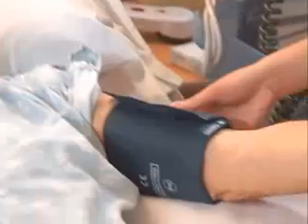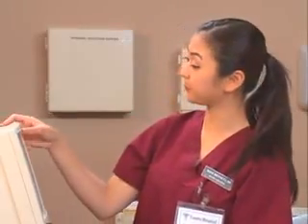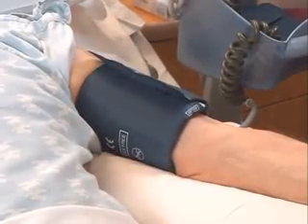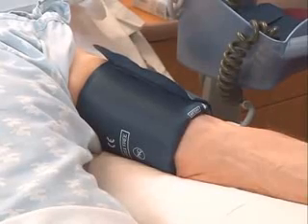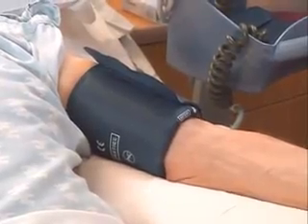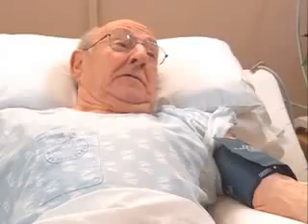Hand down, Mr. Marlin. I'm sorry. Guess I got itchy. That's okay. Now I'm going to turn it on. It'll feel a little tight. Okay, there we go. And the blood pressure reading should appear. There it is. How's it look? Okay, 146/86. That's improved, right?